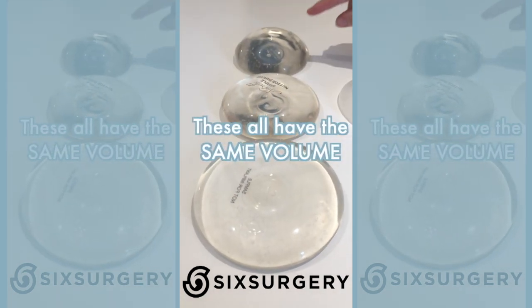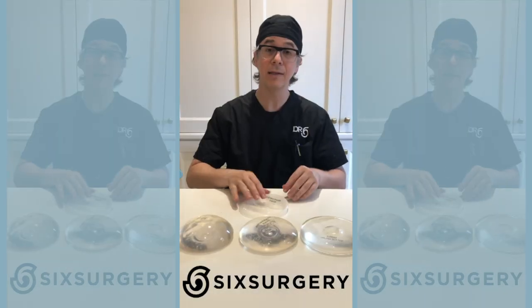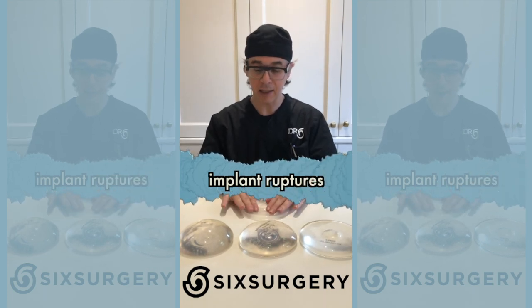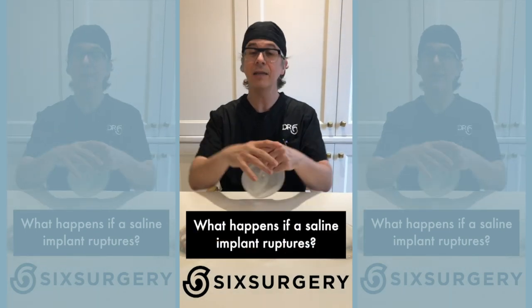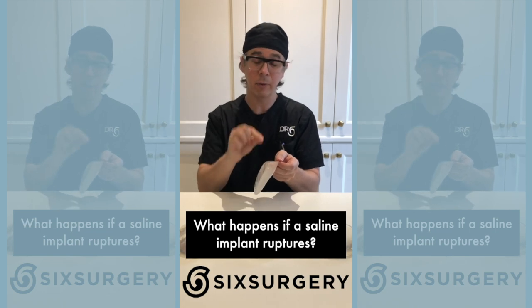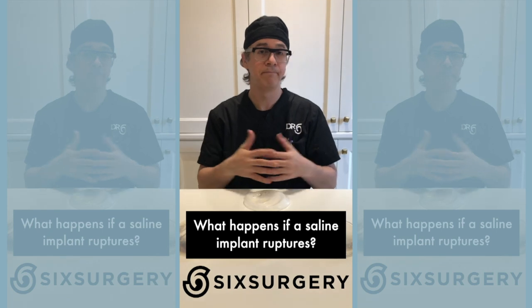These are same-volume implants but different shapes. The saline implant is really an empty shell that we fill in surgery. The benefit of a saline implant is that it's just a bag of water — if it ever leaks and ruptures, the bag doesn't explode. It's just like a little pinhole; fluid comes out slowly and your body absorbs the saline. That's it.